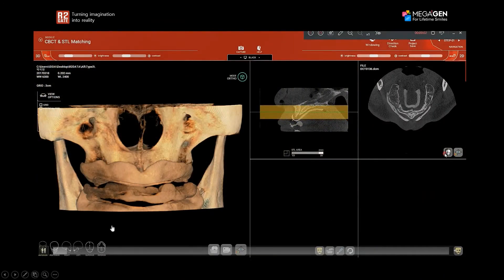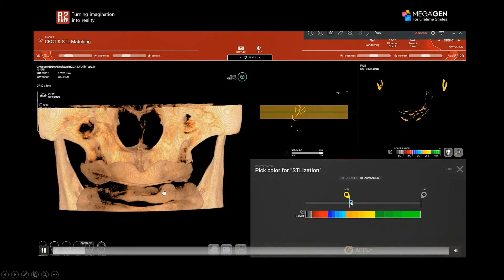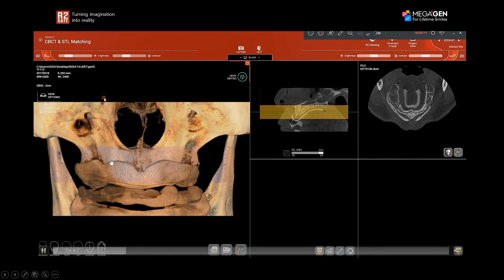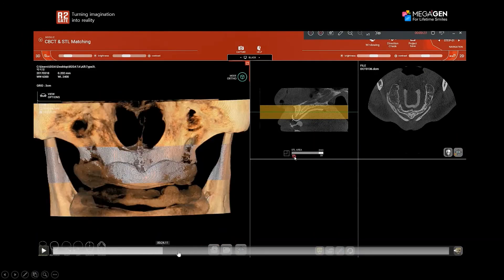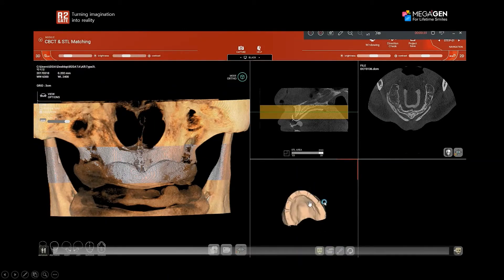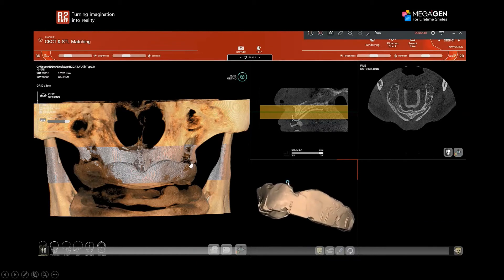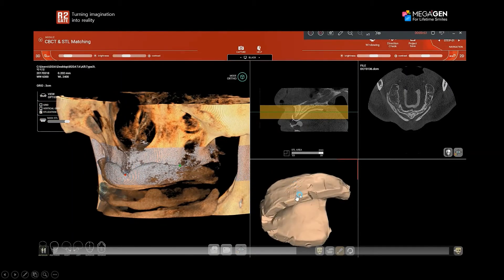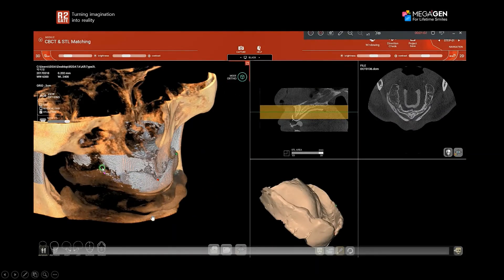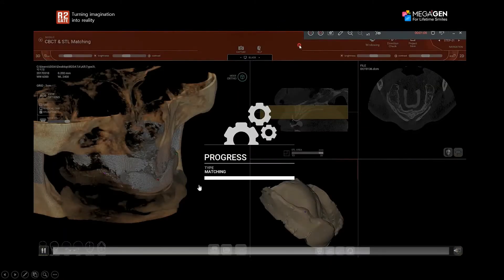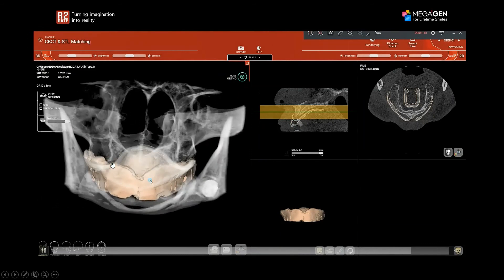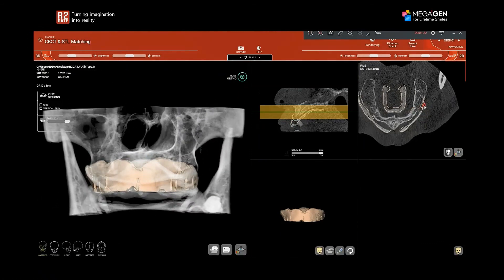Here is a video recording of the R2Gate software showing this process in more detail. I find the threshold that reveals the tray in the CBCT, then import the STL file of the tray scan. I then find matching points between the tray and the CBCT using the top resin part — not the bottom wax portion. I place one point in the center, one on the left side, and one on the right side, then merge the data. The result is the tray matching really well to the CBCT scan — this is how we match a model to a CBCT scan for a patient without a denture.